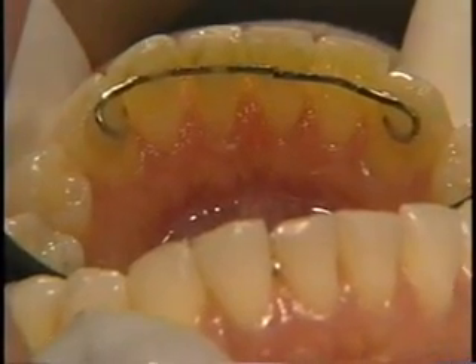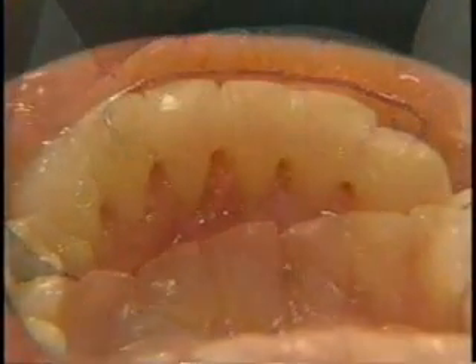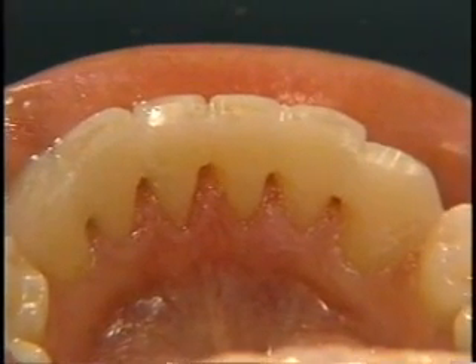Because glass band is a ceramic material, it doesn't exhibit any dimensional changes as some of the plastic reinforcement systems. And I think you'll find that over a long period of time it presents a more reliable, more predictable, more dimensionally stable and therefore fracture resistant type of restoration. I've spent a lot of time developing this system, we've spent a lot of time making sure it's a reliable system, and I think you're going to enjoy using it in your practice.